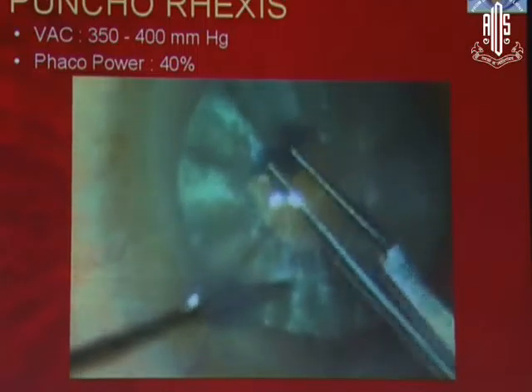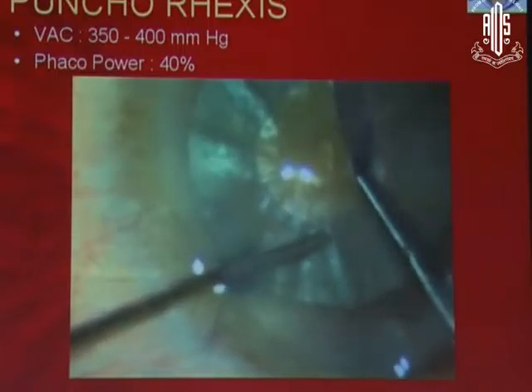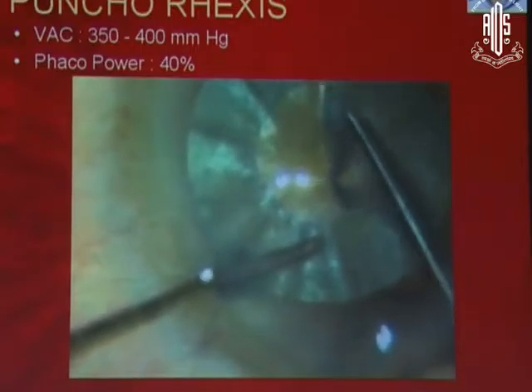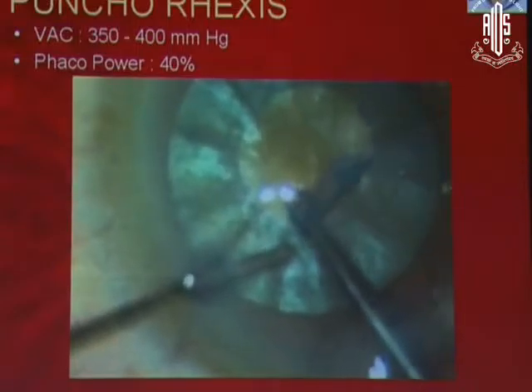If you punch the rexis, you can see here it not only takes care of the intralenticular pressure — it rapidly decompresses the intralenticular pressure — but also it debulks the nucleus as well. You can see here, this is debulking because of the burst of the phaco.